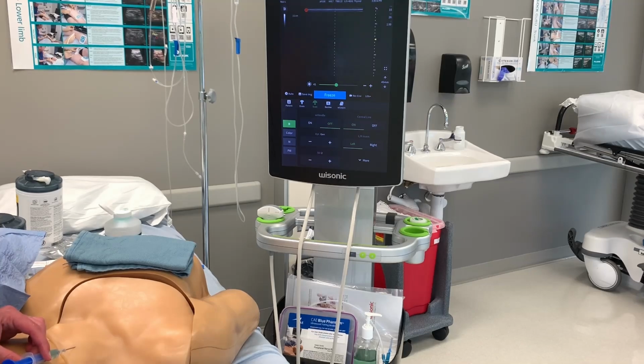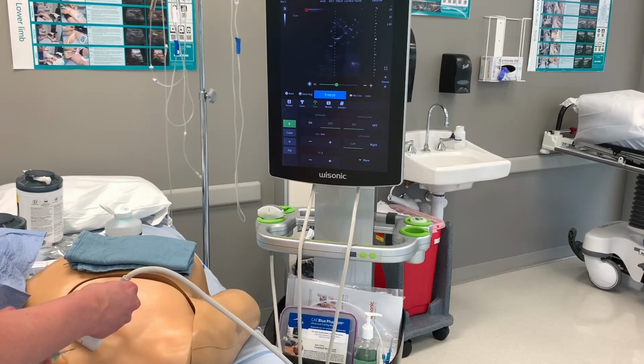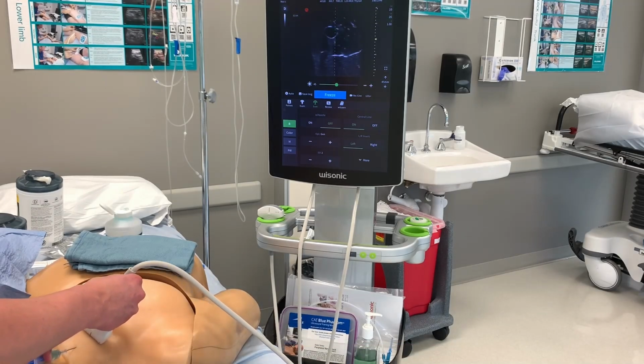Next step is going to be to insert the guide wire, and in this case we can do a through the needle technique. You can't do that for all of them, but this needle allows it. Going to confirm guide wire placement. It's kind of hard to see, but there's a brief second where it comes through really clear even over at this angle. So here's the top of the vessel wall. Just beneath it, you'll notice a little hot spot. And what I say by hot spot is it turns bright white, like right here. Bingo, there it is. That's confirming our placement.